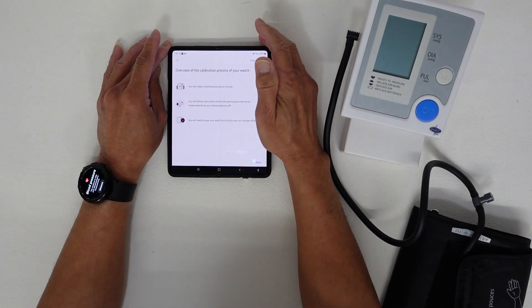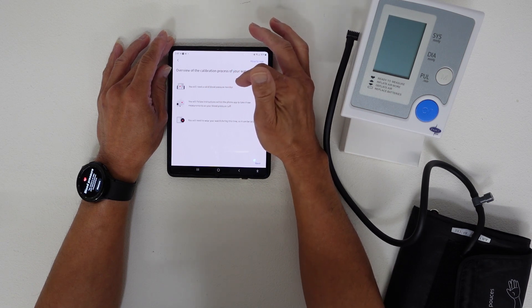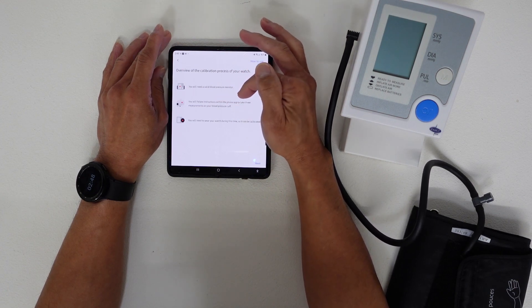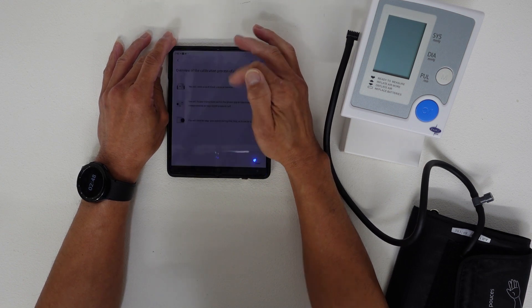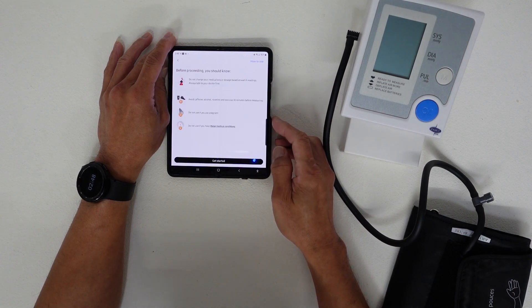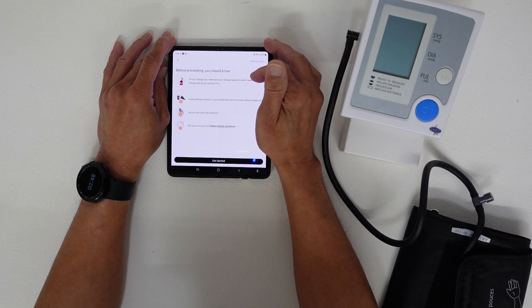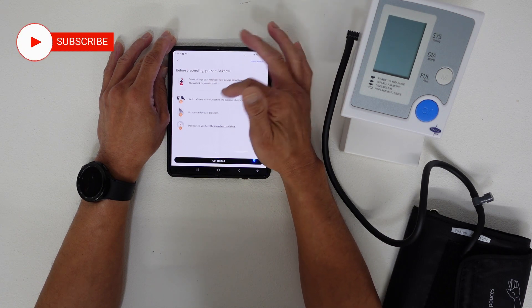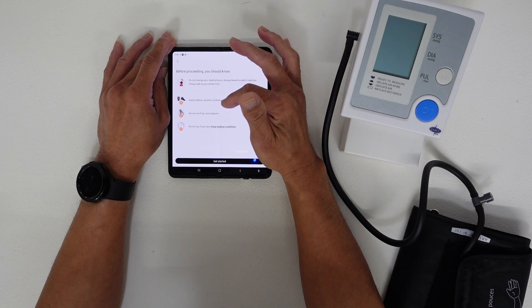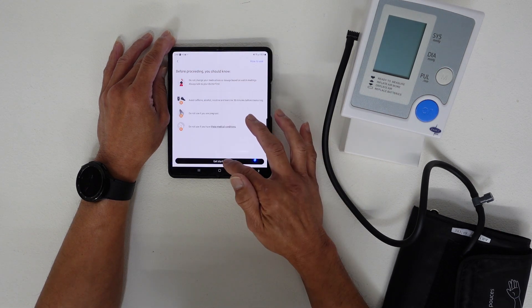The app gives an overview of the calibration process: you will need a valid blood pressure monitor and will follow instructions within the phone app to take three measurements using your blood pressure cuff, while wearing your watch so it can be calibrated. Important precautions: do not change medications based on watch readings, avoid caffeine, alcohol, nicotine, and exercise 30 minutes before measuring, and do not use if pregnant or if you have certain medical conditions.